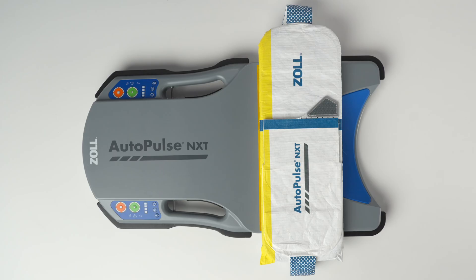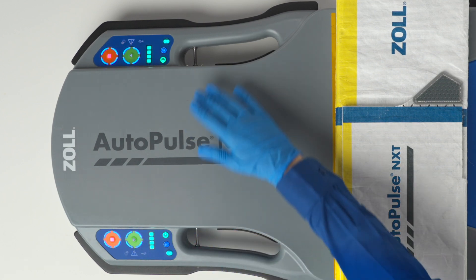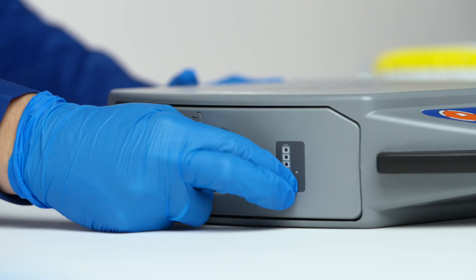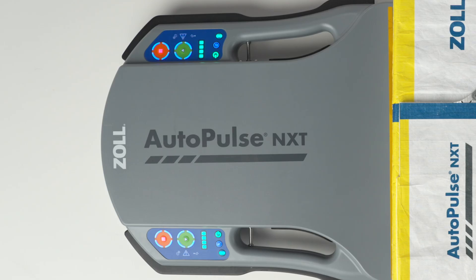Next, install the band. Refer to "Installing and Removing the AutoPulse NXT Band" for detailed instructions. Turn the platform on and look at the user control panel on either side of the platform. Ensure the battery is fully charged and the AutoPulse NXT band is installed properly. If there are four bars illuminated and no alarm indicators illuminated or flashing on either control panel, AutoPulse NXT is ready to deploy.